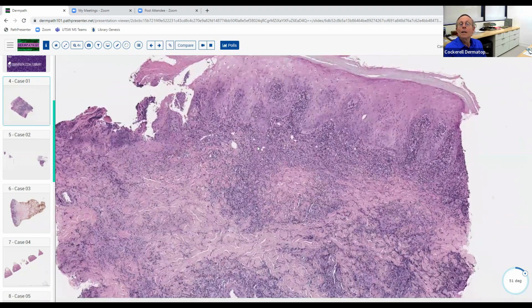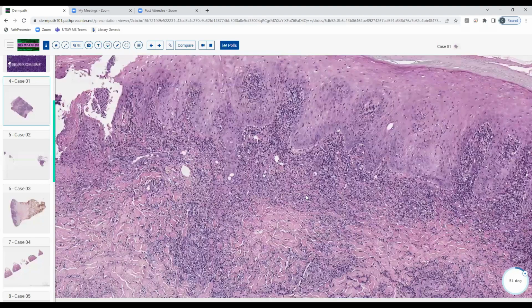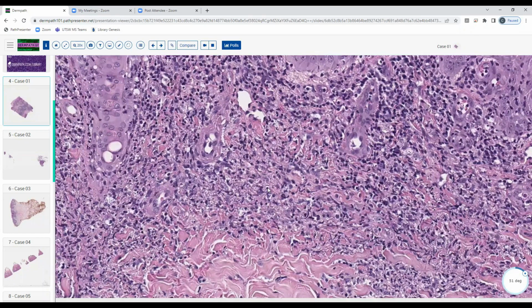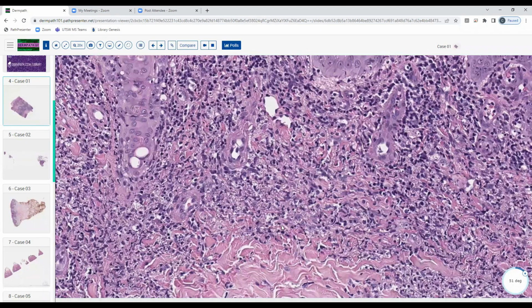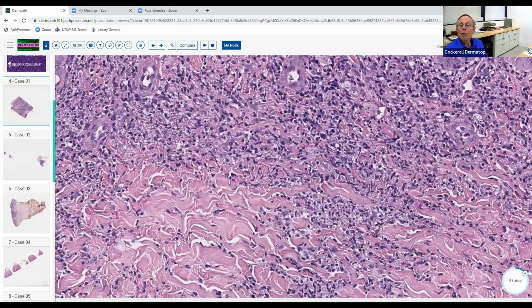Okay. Yeah. Any particular infections that like to give this pattern? Well, I was looking a little bit closer, and you see these dots and spores to me, kind of surrounded by a clear space, and that made me think of histo. Okay, so you're seeing some little dots here, and there's also quite a few lymphocytes that infiltrate here. There are some neutrophils. So there's a differential diagnosis when we have, what do you call those dots? Where are they located, actually? They're within the histiocytes, is that correct? Good, they're within the histiocytes.